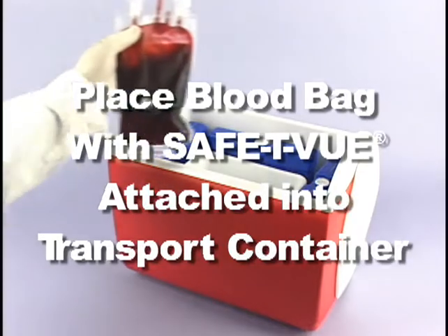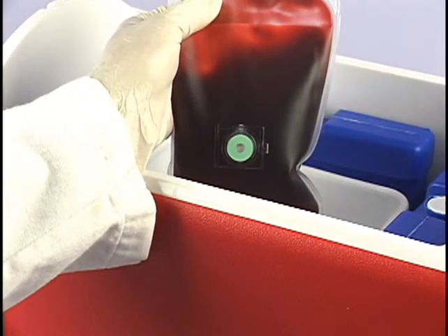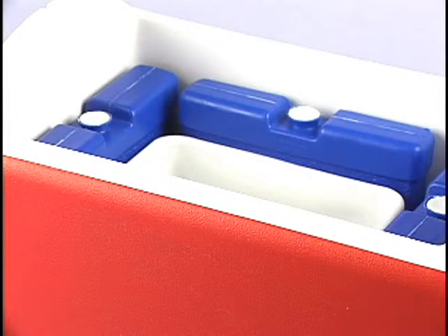Place the blood bag with your activated Safety View attached in the cooler and complete packing following your packing protocol. We suggest the topmost layer should be wet ice or cold packs to keep warm air from the blood bags or other temperature sensitive items, as suggested in our FAQs insert.